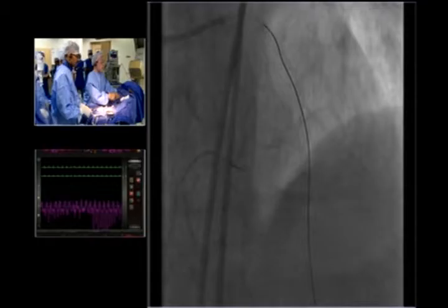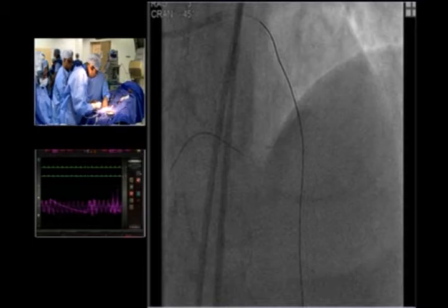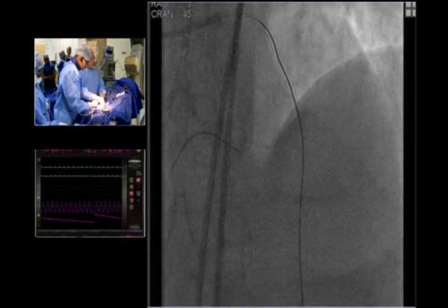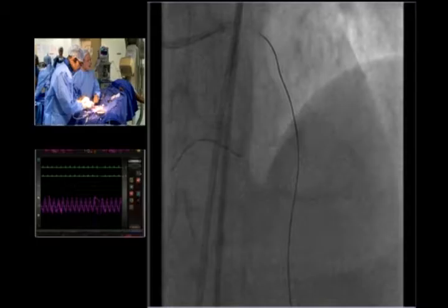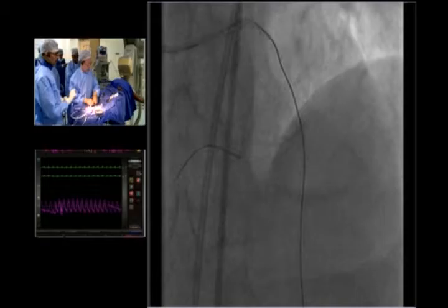The seven French catheter, yes. Guidezilla and microcatheter. Yeah, yes. Very easily. Okay. Have you given the nitroglycerin? No, I have it ready. Please. Okay, we're going to stay with you for another minute or two, and then we'll let you work in peace and can always come back. Okay, nitroglycerin was given.